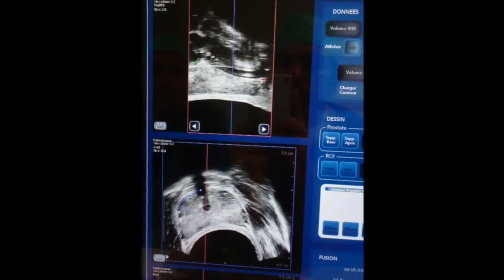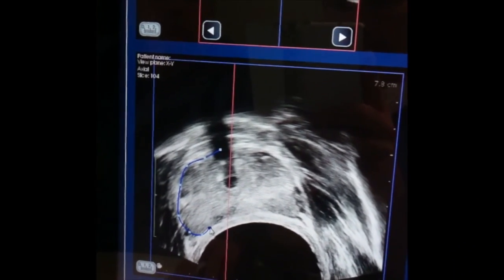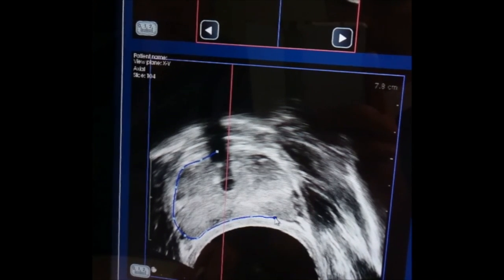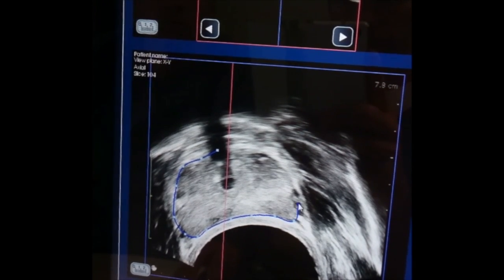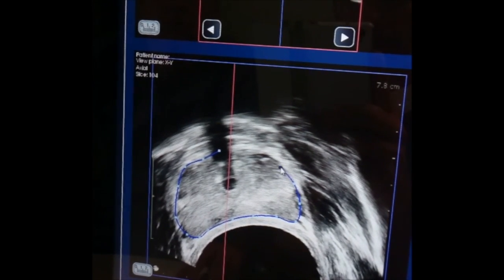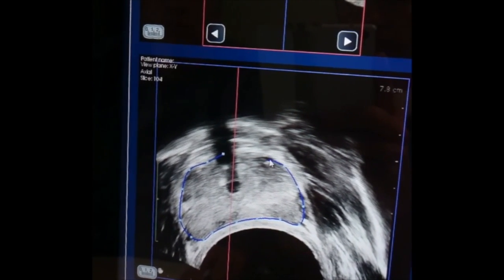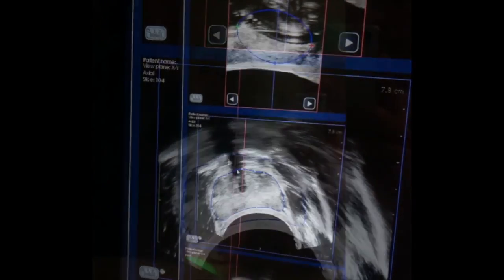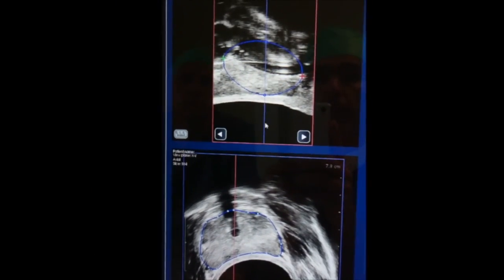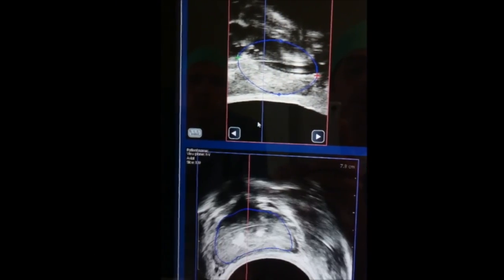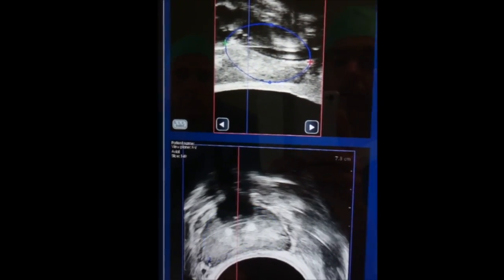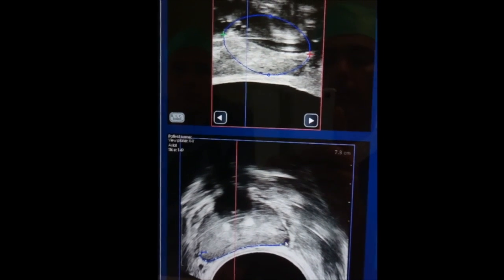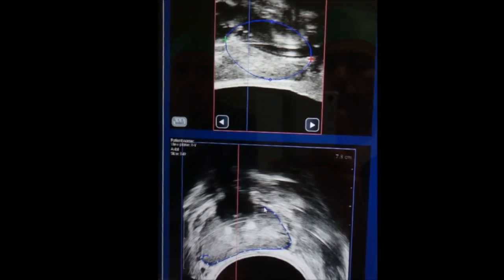As for the MRI mapping, you just need to draw the prostate at the base, the middle, and the apex of the prostate. You can see the very high resolution of Focal One echography, essential for the delineation of the apex and the neurovascular bundles.